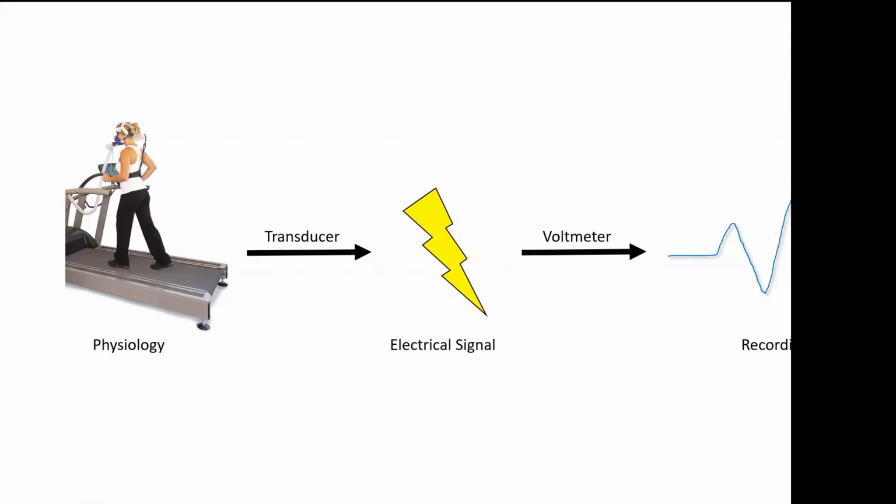Okay, so whenever we're talking about transducers, we're really talking about any of the devices that we use to take measurements about the body when we're hooking them up to an actual reader.